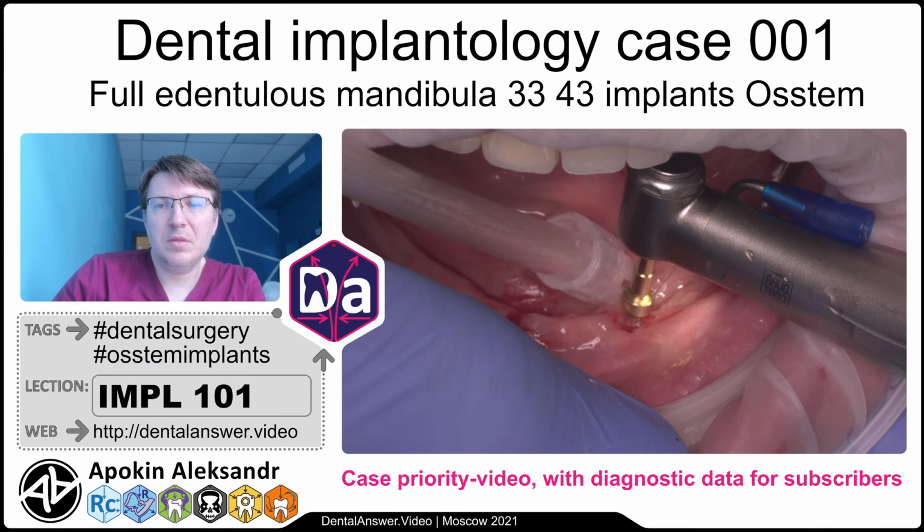Good. We're also checking every time for paralleling with parallel guides. The other implant side was also drilled with this last diameter drill, 2.5 mm, on the full depth, also for bone level placement of the implant in the mental area.